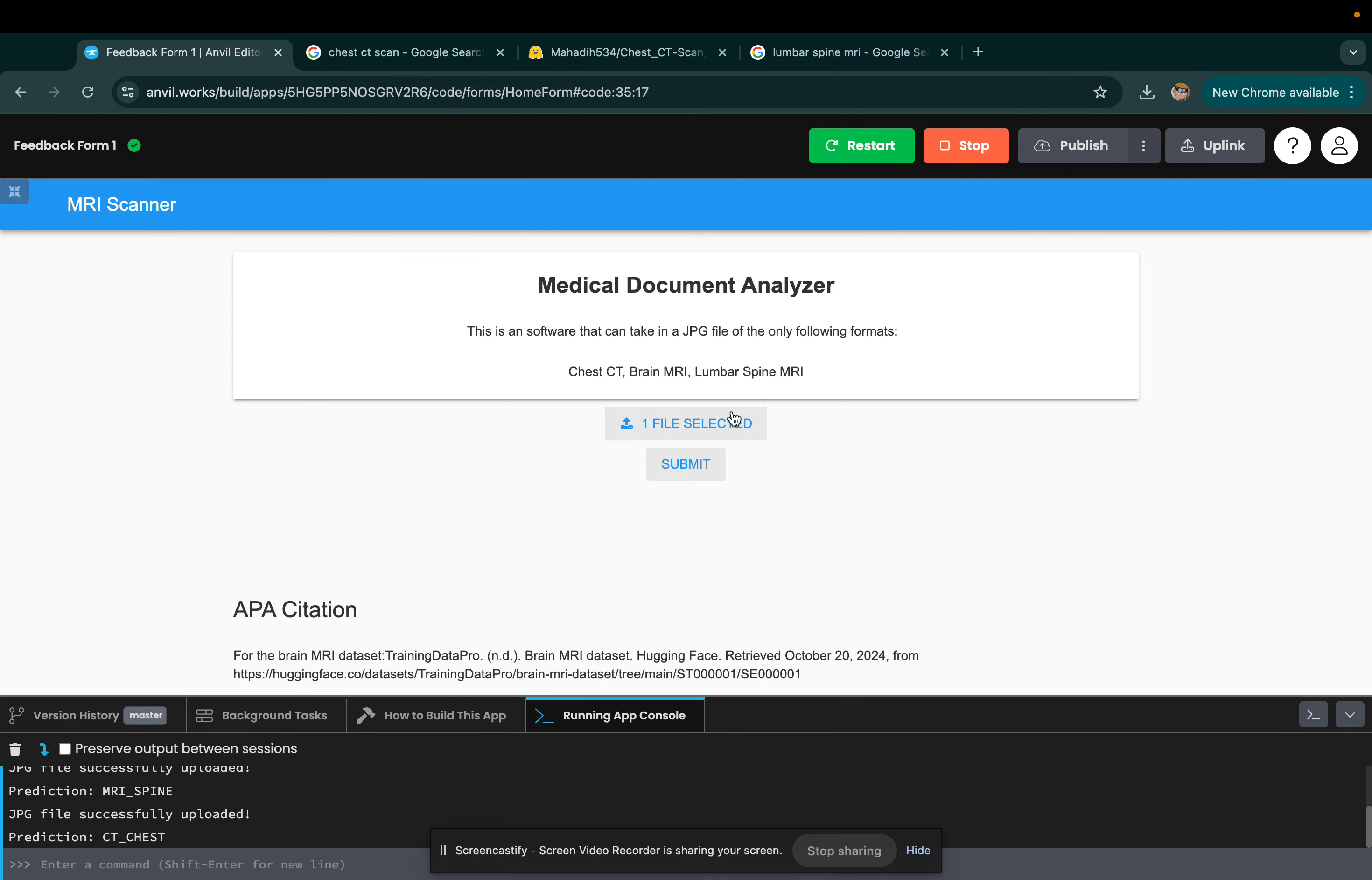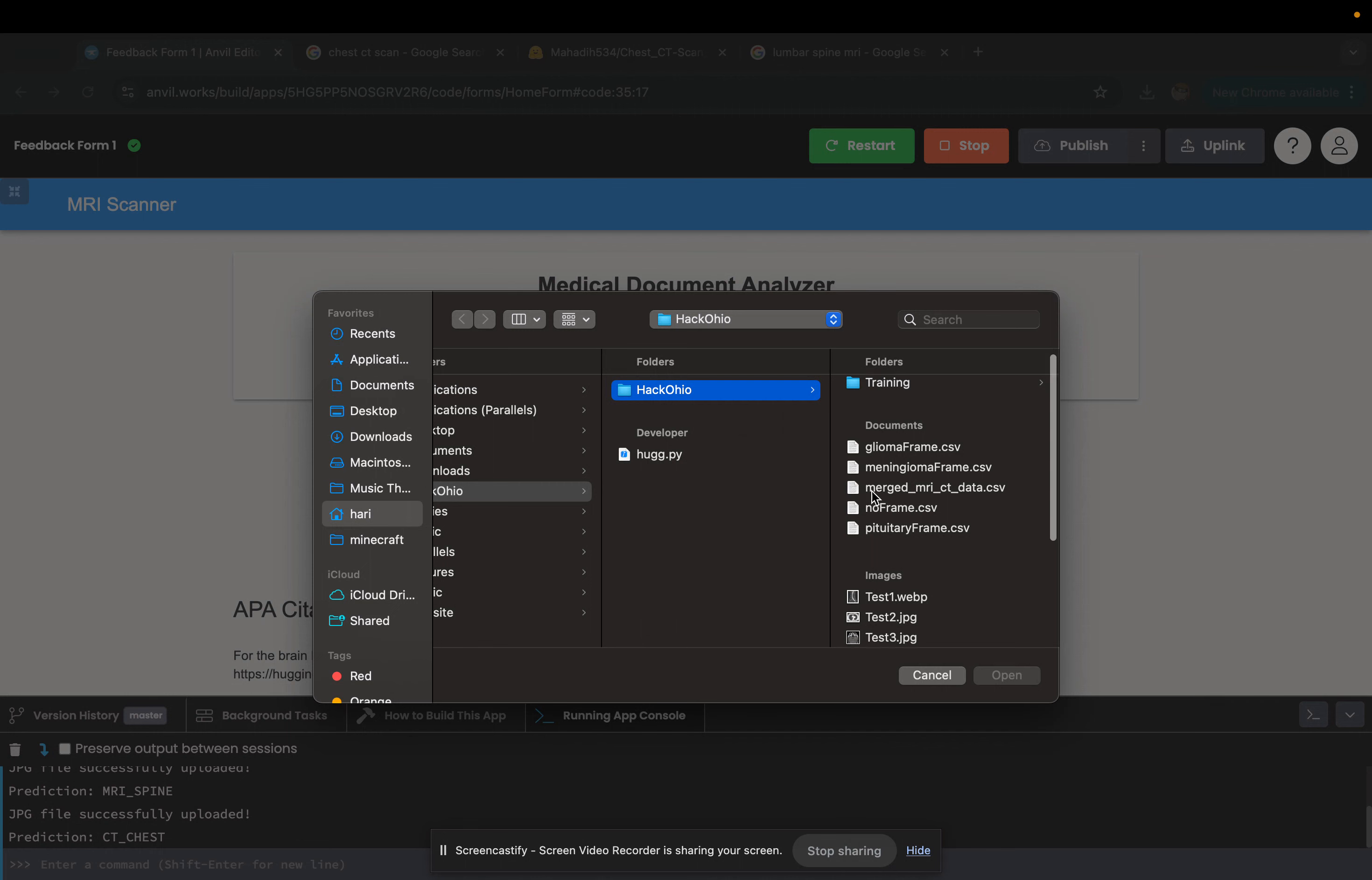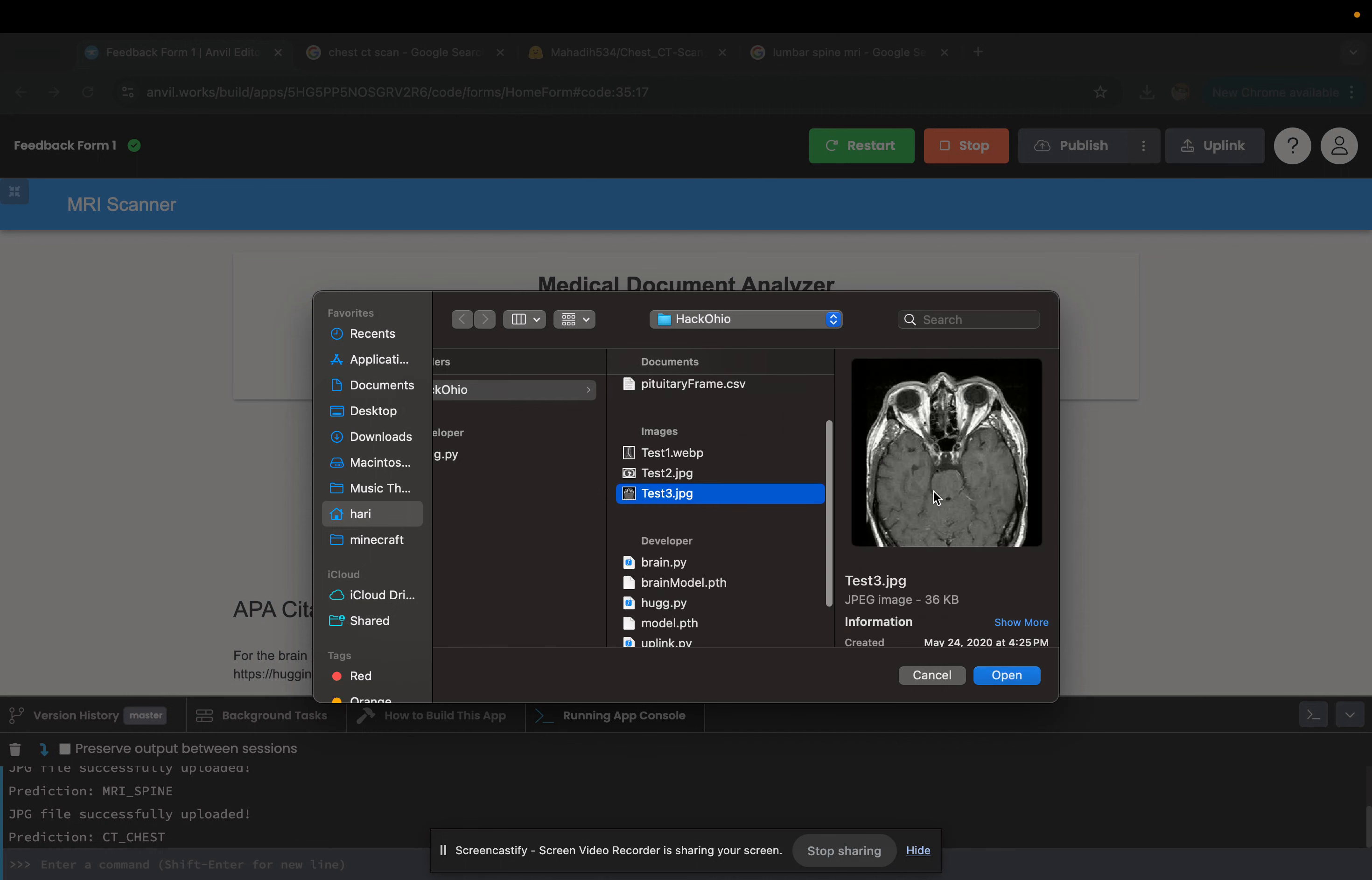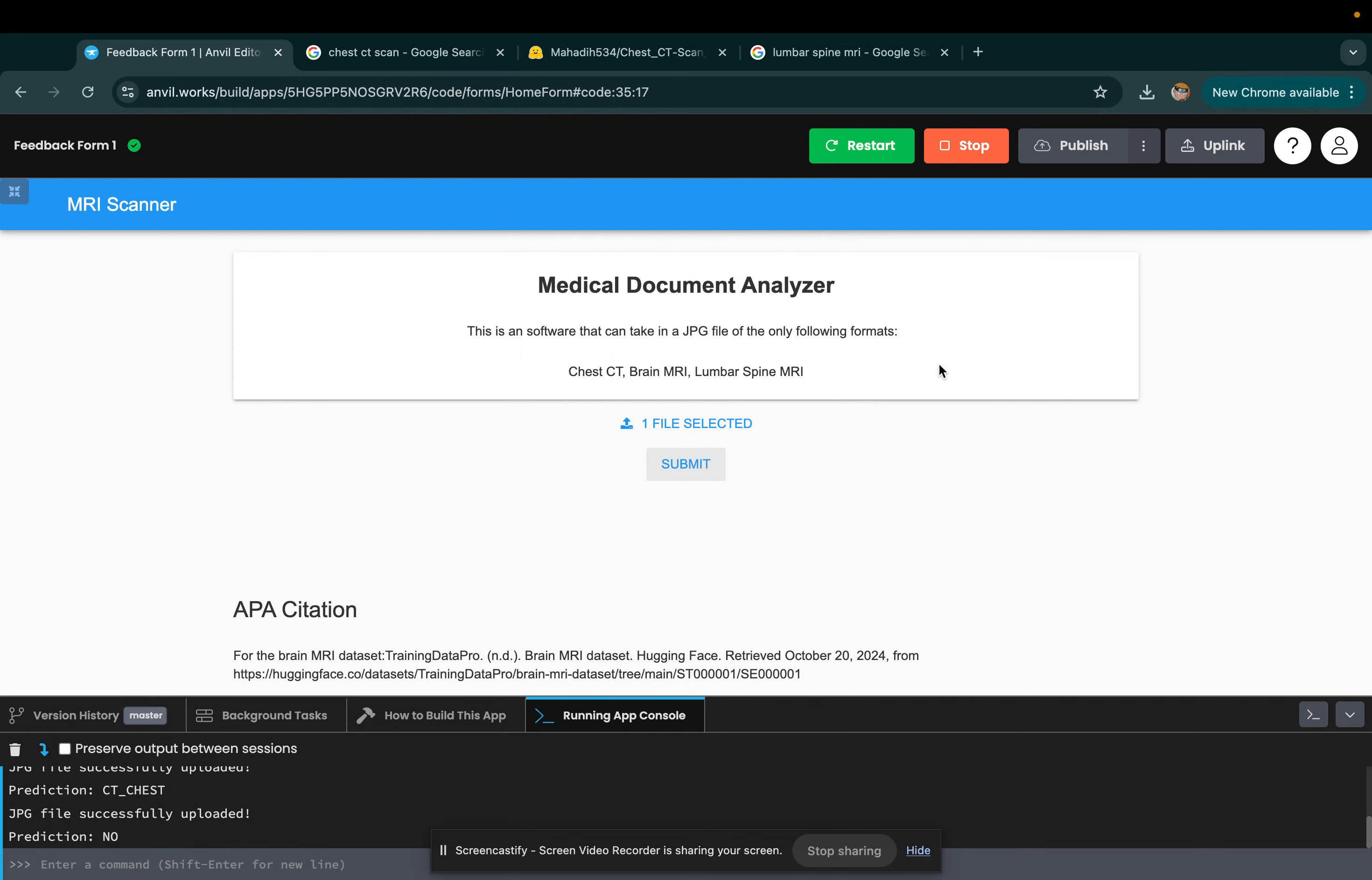We have a chest CT here, but that's not all. We can also diagnose brain cancers. This is a perfectly healthy brain right here. As you can see, we can open it into the application and we submit it, and no cancer at all, completely healthy.